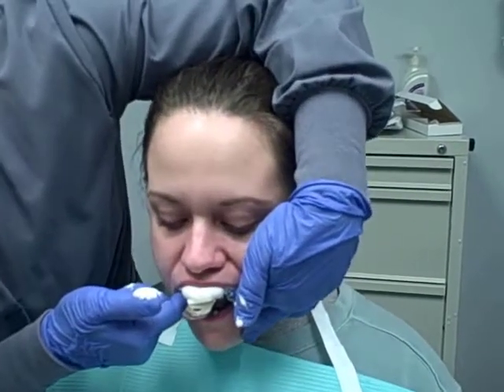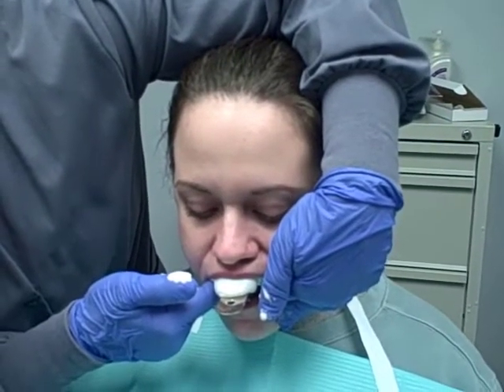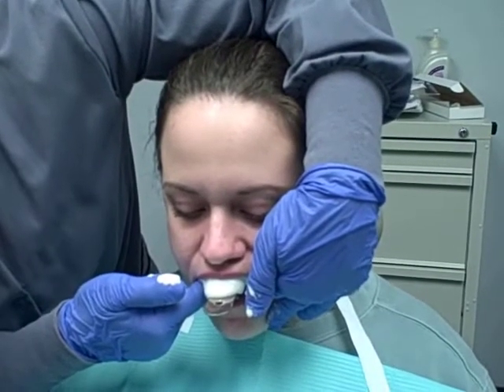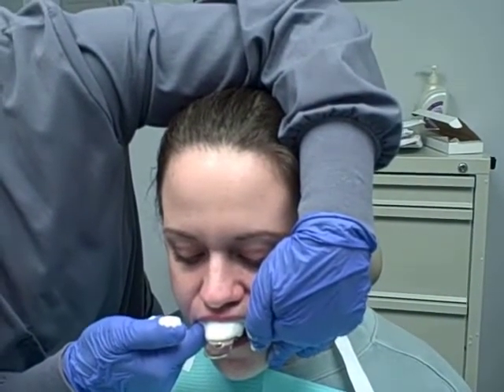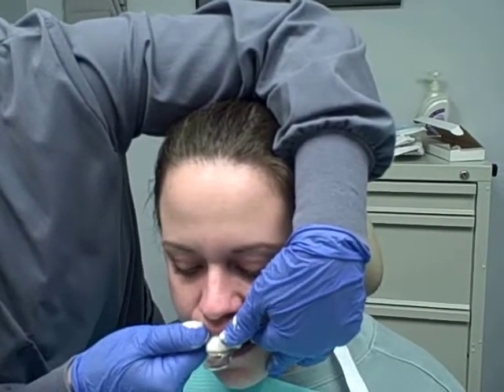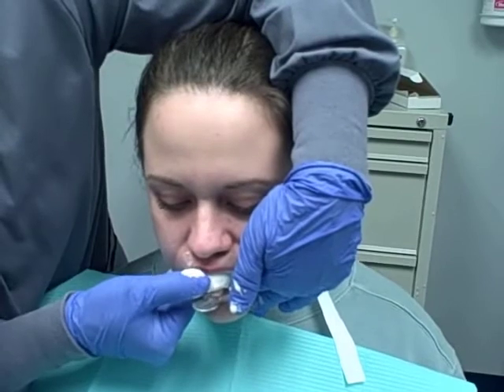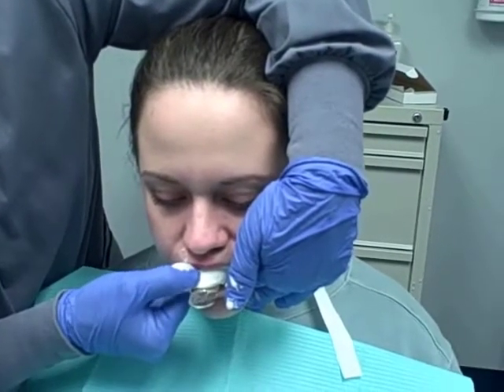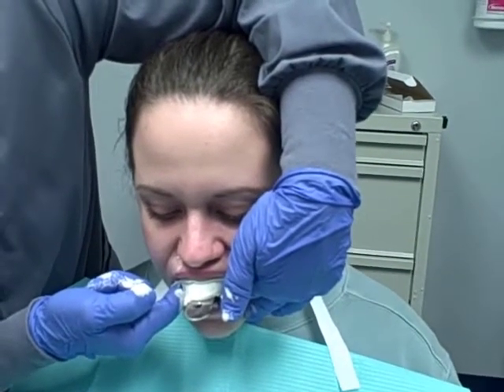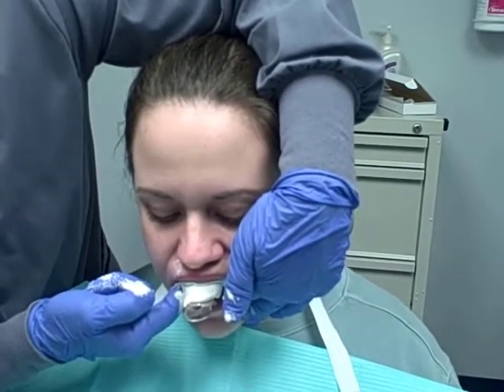Lean forward, please. And I'm going to hold it here in the premolar area, with it seated in the back. There's a little bit of pressure from my arm onto her head, kind of holding it in place. I want any excess to slide towards the front or be up in the vestibule. About a minute until it sets. You'll notice for the maxillary I'm standing behind; for the mandibular I stood in front. Don't forget to dry the teeth before you put it in, and then put some extra alginate on the occlusal surfaces.